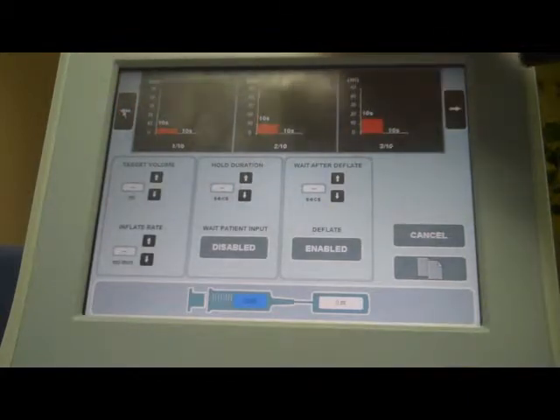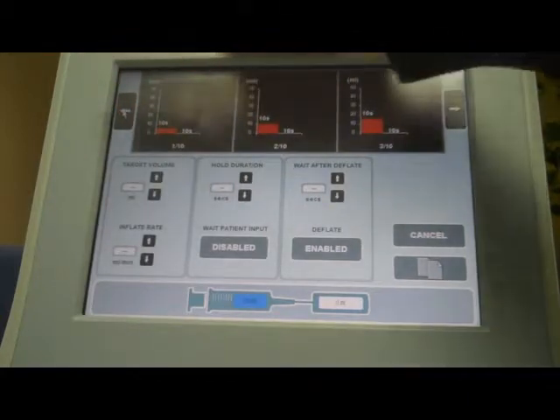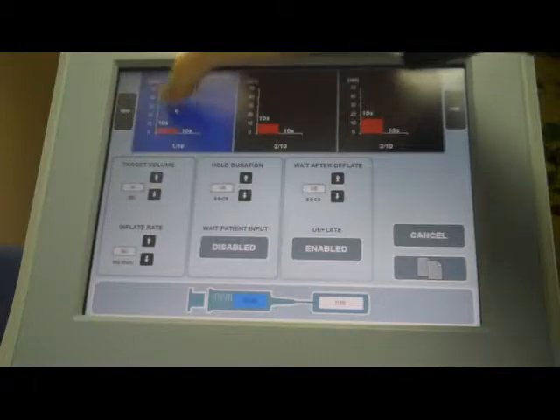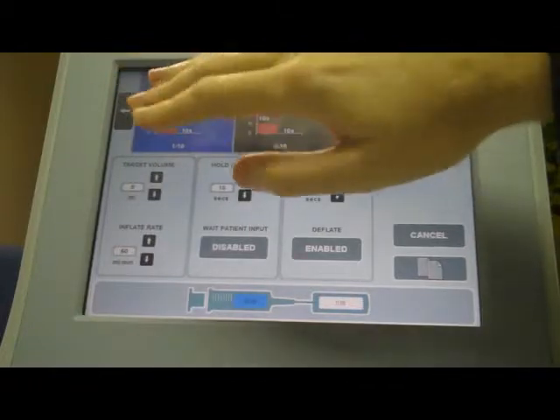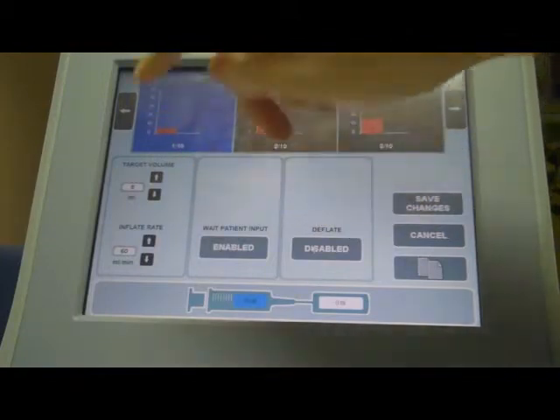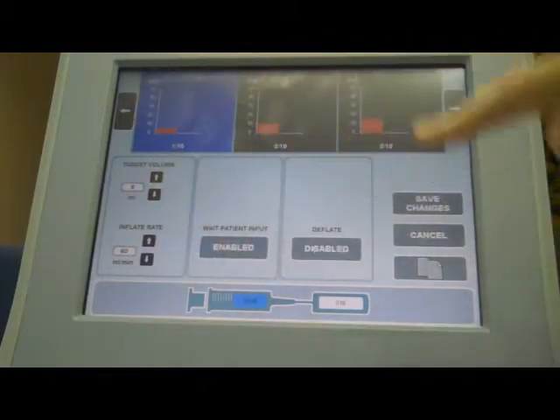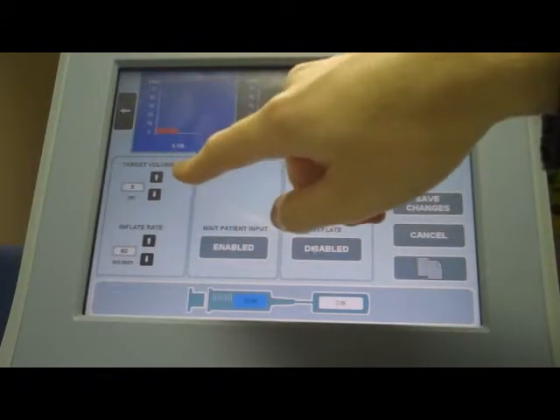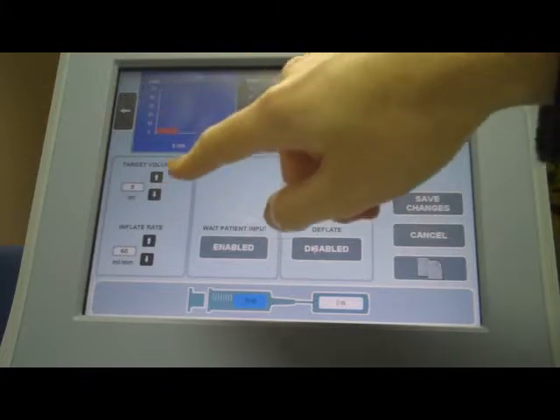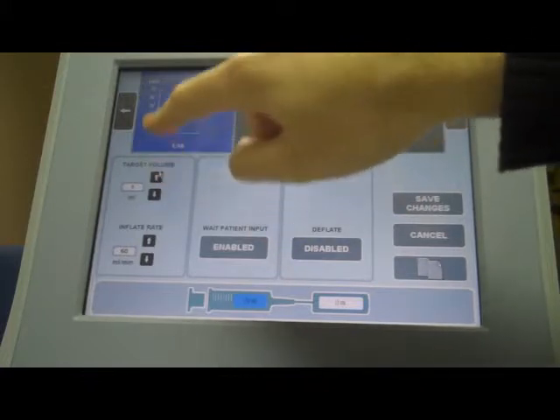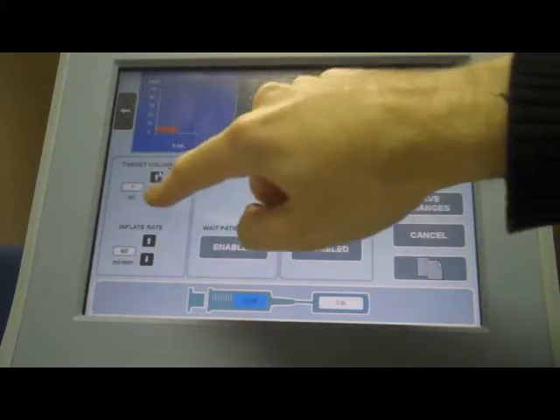To configure each individual step, you select the step you want to configure — it'll then be highlighted. You have options of configuring here. The first option is to configure the volume — this is the volume it will inflate to. As you update that, you'll see it updates on the graph.